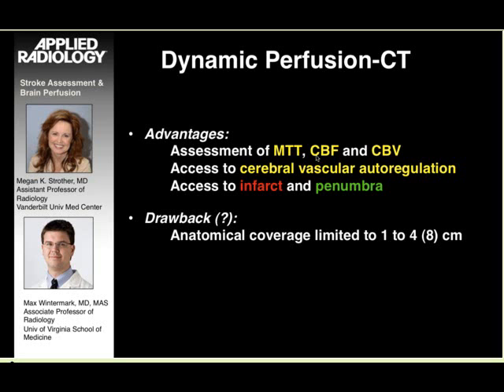And that's why I wanted to draw your attention. I discussed at first this big group of perfusion CT technique called whole brain CT perfusion. And that's something that you don't want to confuse with dynamic perfusion CT, whether the coverage for this dynamic perfusion CT is limited to a couple of centimeters or is very close to whole brain coverage. Because again, the approach and the type of information that you can extract is very different. So that was kind of my first message.